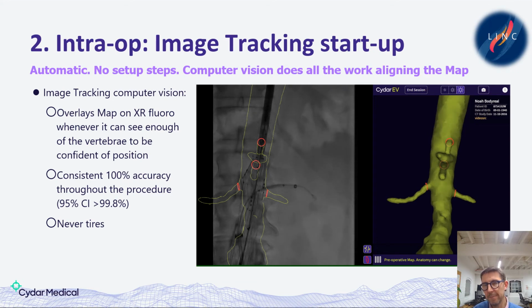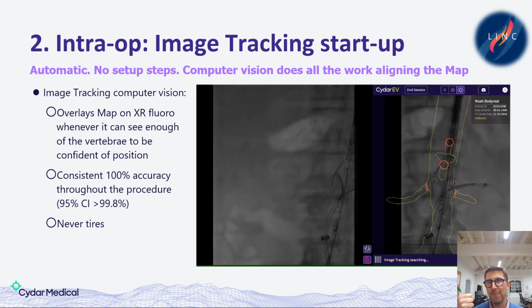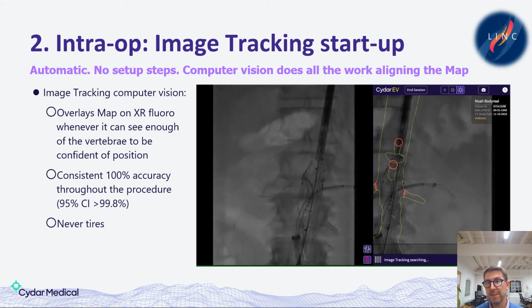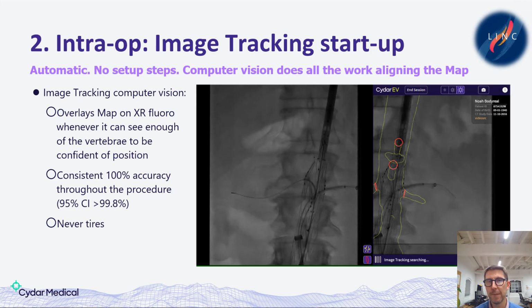And that map there, we've so far overlaid about 250,000 unique solutions in real clinical use, and there hasn't been a detectable error in a single one to date. So to be clear, that green map is the preoperative map being overlaid. And so you will see discrepancies, as you can see there on the right at the moment, between where the map is and where the real-time anatomy is. Now, crucially, that's telling you the anatomy has changed. It's not that the overlay is in the wrong place. The anatomy has changed because of the stiff wires and the stents in there.